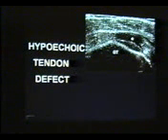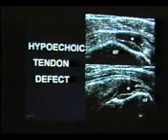Here we have a hypoechoic tendon defect. This is the tendon, two sides of the tendon. A small area is showing continuity, whereas most of the tendon is showing discontinuity. So this is a maximal partial tear of the tendon, which can be confirmed. Absent cuff, as the deltoid is in contact with the humerus. There is no tendon in between, and it was confirmed on the other axis.